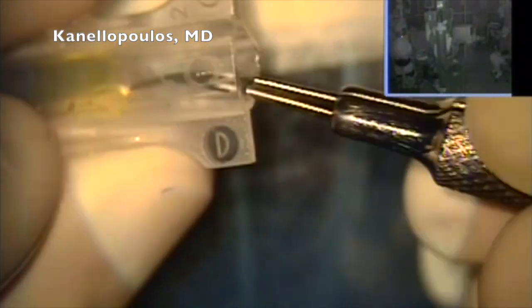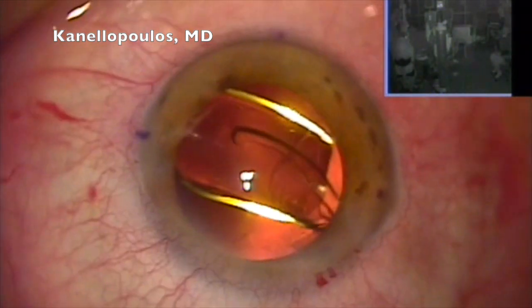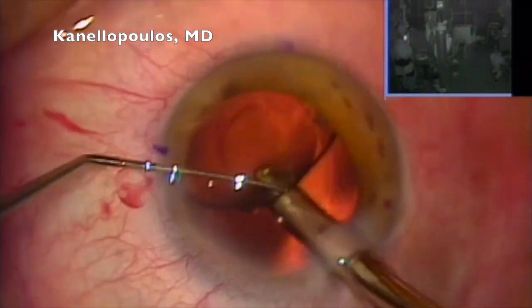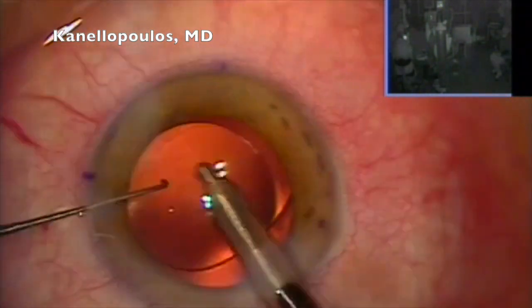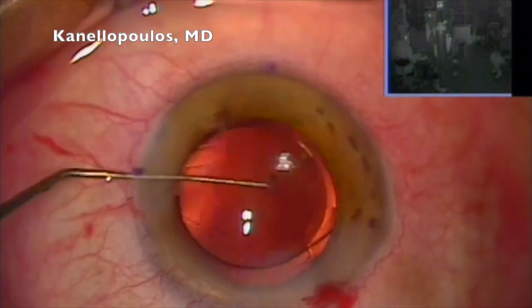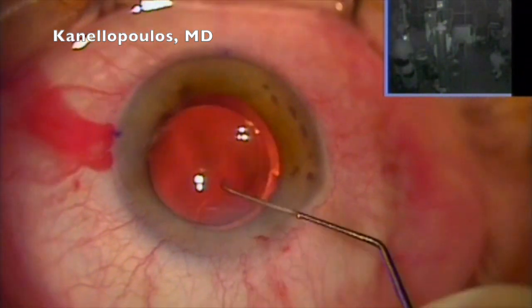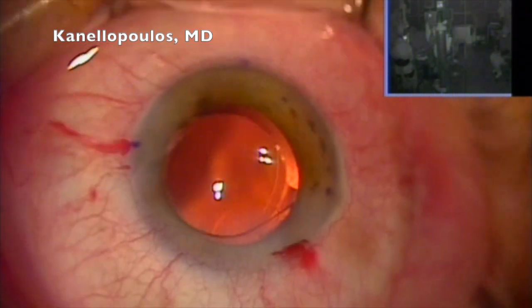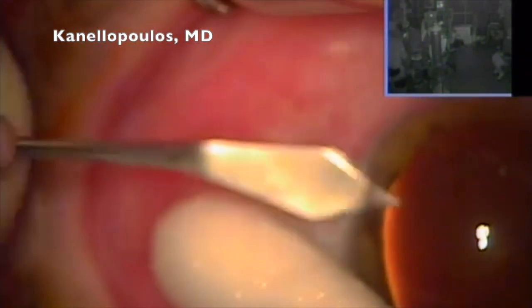Again, a significantly toric lens, same technique. And this is the key of successful surgery, I think, to be very consistent. Again, under the lens, remove the residual viscoelastic, very carefully, since I'm using a lot of visco, to remove it so we don't get IOP spikes the day after. Also very meticulous in centering the lens. Going in back, also have the lens captured by the anterior capsulotomy.